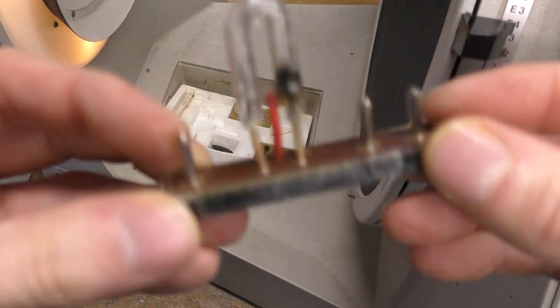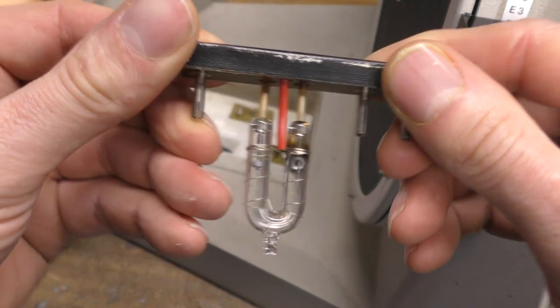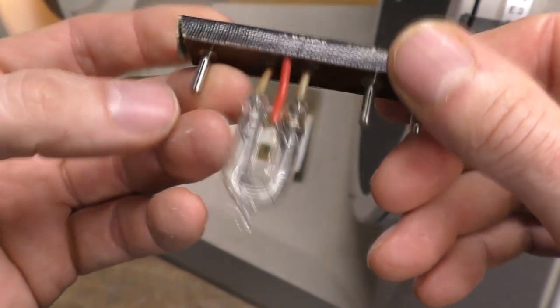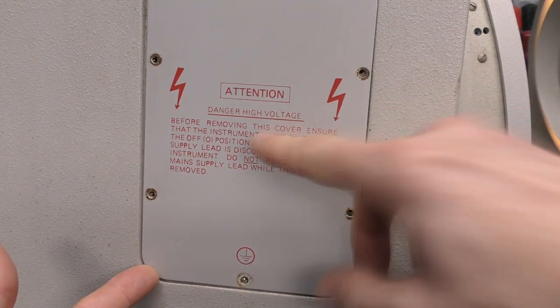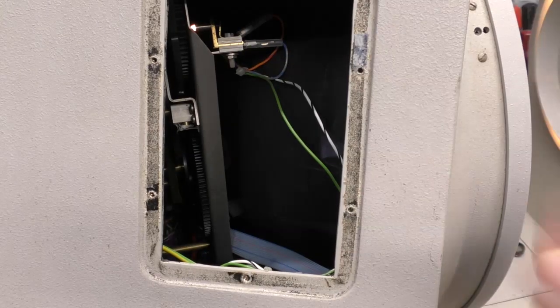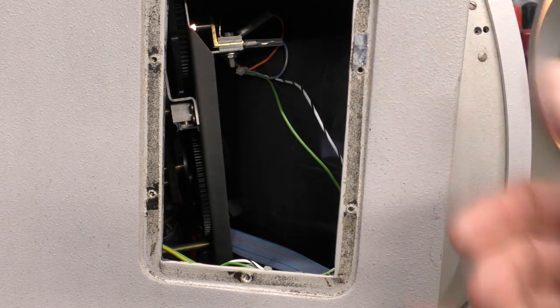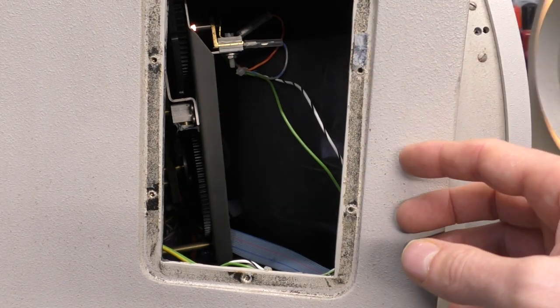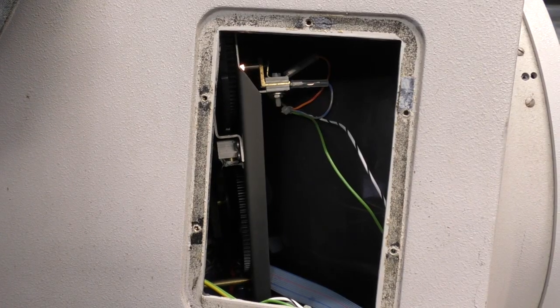This is just a fairly standard, small xenon tube mounted on a plug-in assembly, and this is designed for easy access. This can easily be replaced. And there's an access cover on the side with high voltage warnings, but there's no interlock switch on this. If there's a cover like this on a more modern piece of equipment where there's an obvious access cover, you might expect there to be some sort of interlock to turn the mains off when the cover's removed. And you can see the lamp flashing.